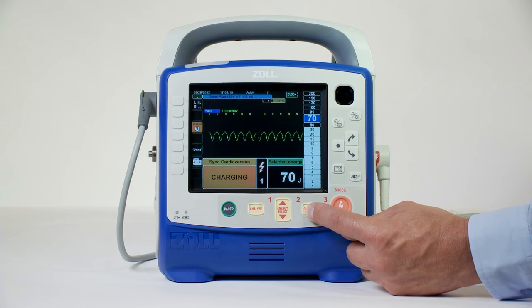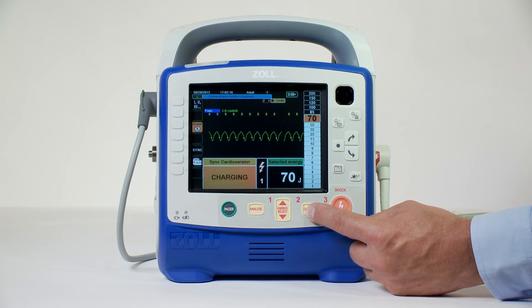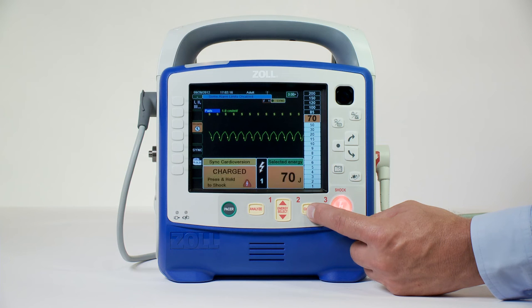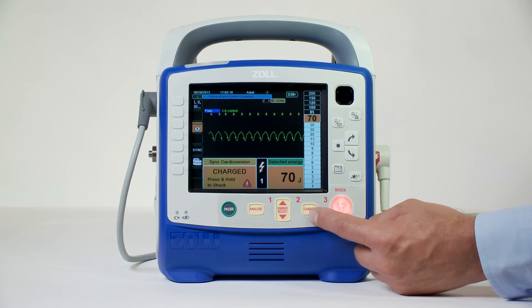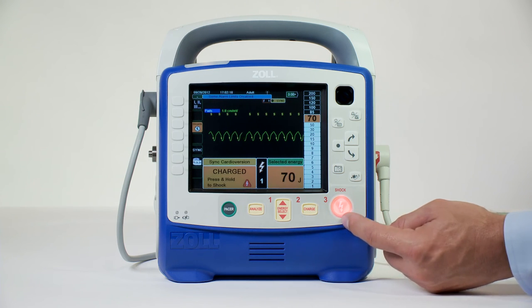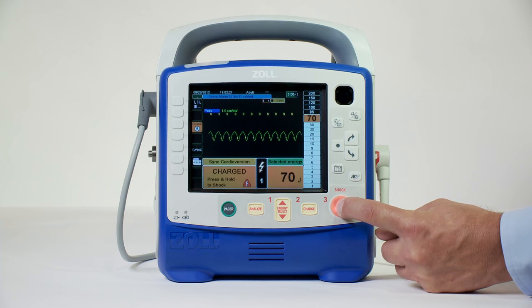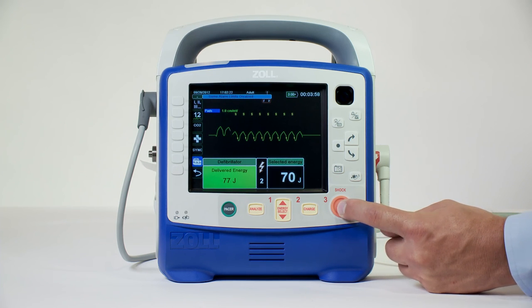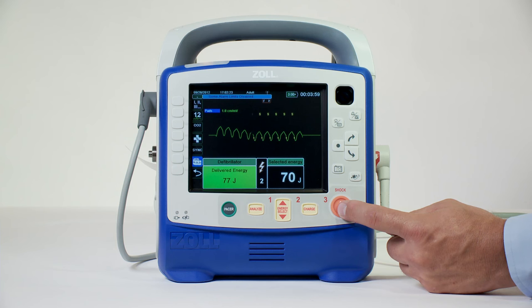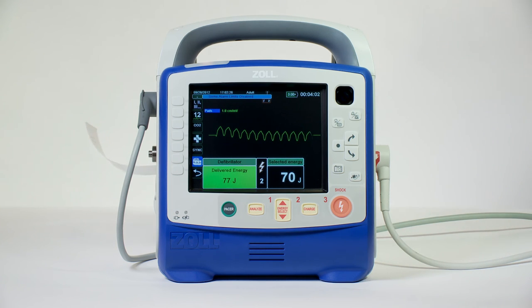Press the charge button on the front panel. Verify that the ECG waveform is stable and that the sync markers appear over each R-wave. Press and hold the illuminated shock button on the front panel until energy is delivered to the patient. The defibrillator will discharge with the next detected R-wave.